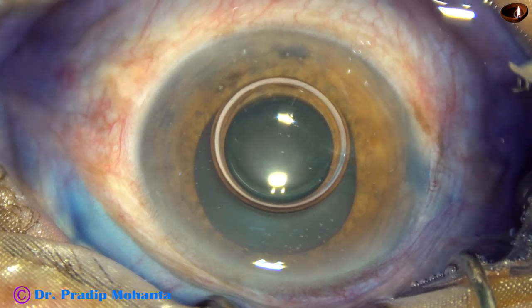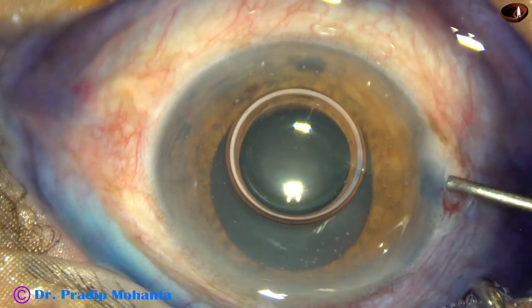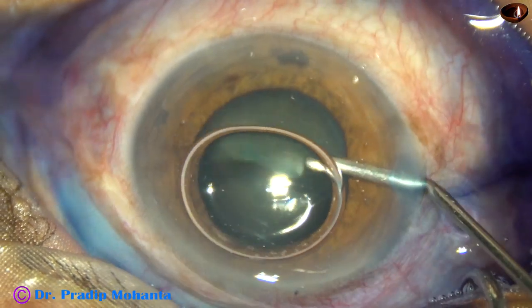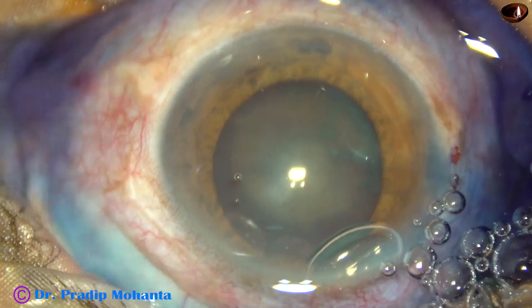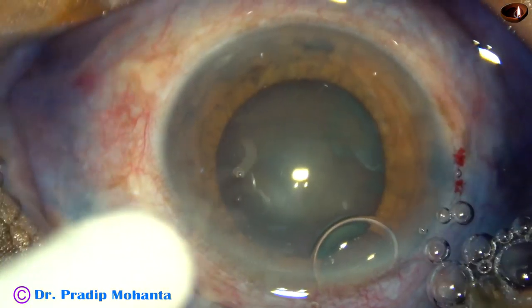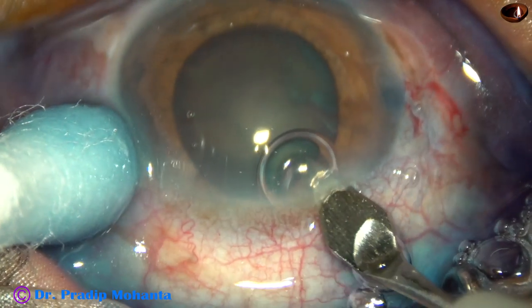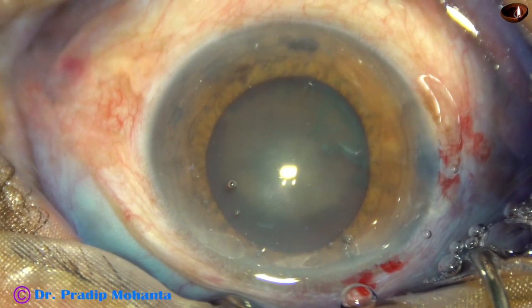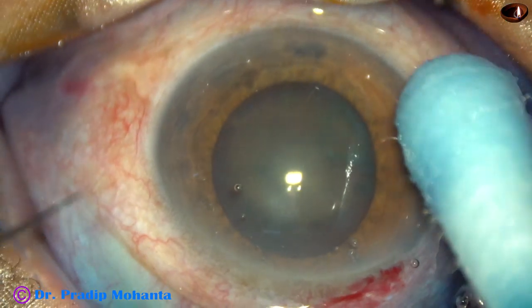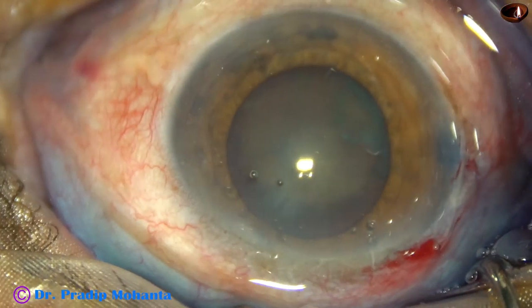Then 2% hydroxypropyl methyl cellulose is injected into the anterior chamber. And now this is the main incision at around 11 o'clock, and then another stab incision on the left side of the main incision at around 1:30 o'clock.